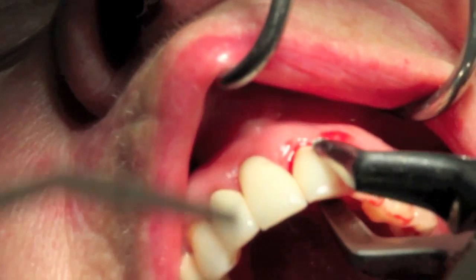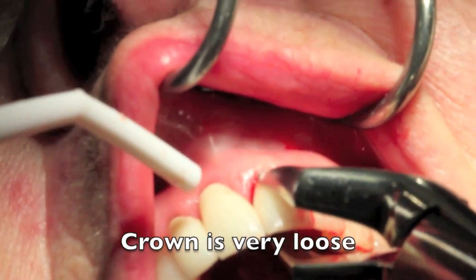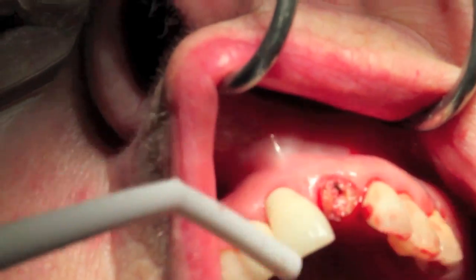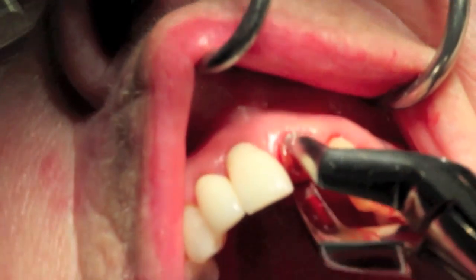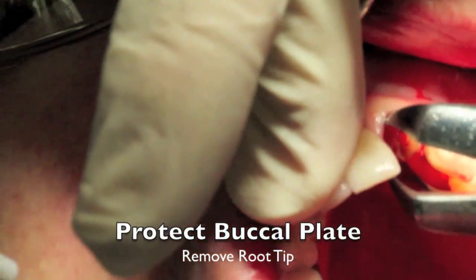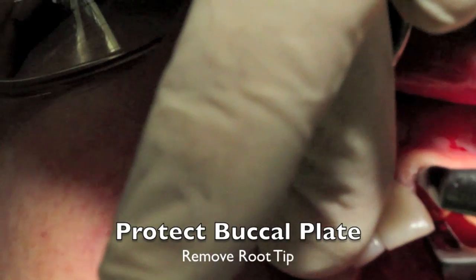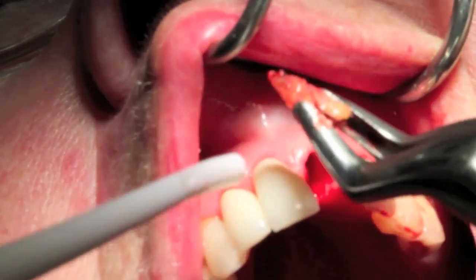Now it's very likely that the crown will come off during this procedure because it's only glued on very lightly because of the actual structure that's underneath there. So once we get the crown off, we want to make sure we're taking this root out without damaging that buccal bone, because the buccal bone is where we're going to have to do some bone grafting later on, and so we need to maintain this area for aesthetics and also for the success of this treatment.